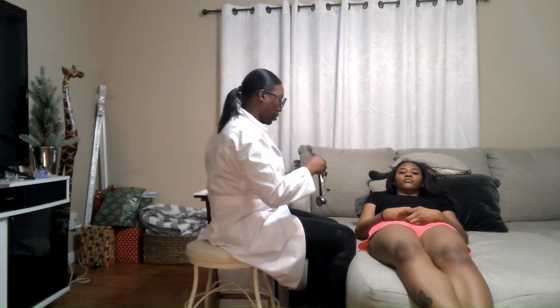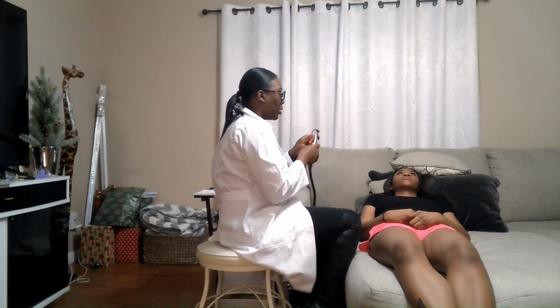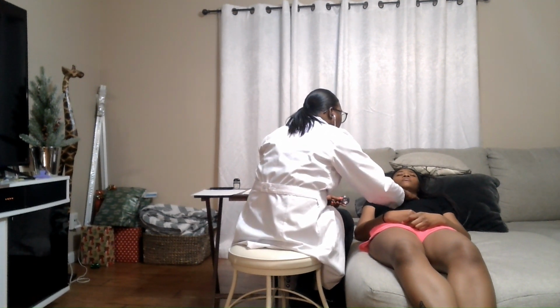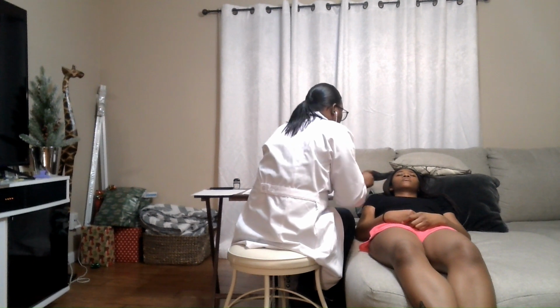All right, so now I'm going to check your heart sounds. There are 5 heart sound areas. I'm going to find your sternal border again, your sternum, and come down to the second intercostal space. I'm going to listen to the aortic heart sound. It's on the right side, second intercostal space. Pulmonic is on the left side, second intercostal space, and that's where you hear S2 the loudest. I can hear S1 and S2, but S2 is loudest there.